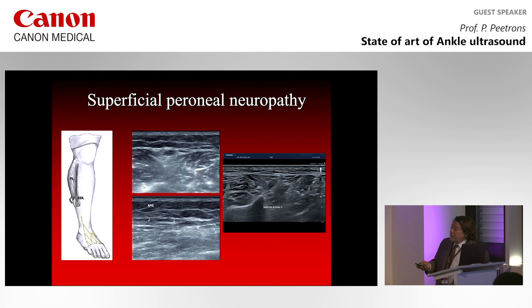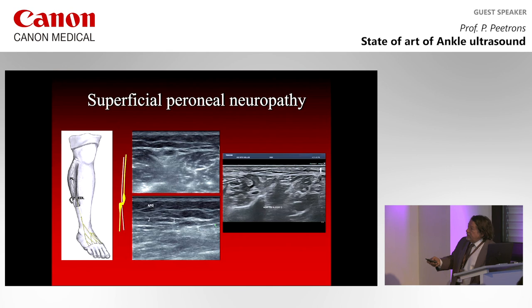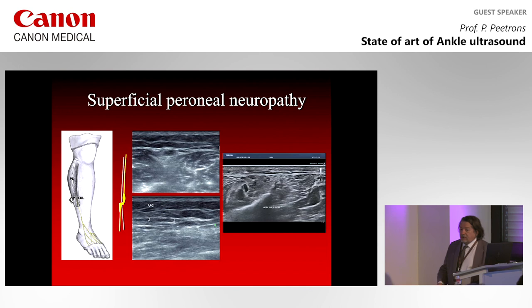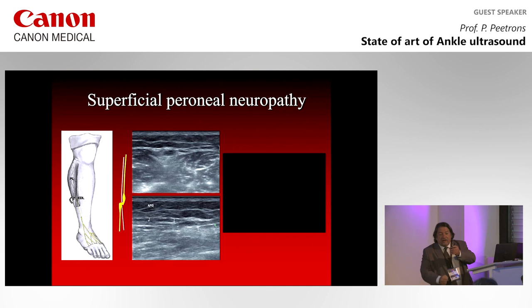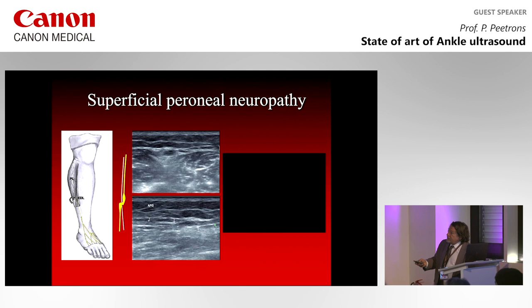So more or less 15 centimeters above the malleolus, then it stays under the aponeurosis of the leg for 5 centimeters more or less, and 10 centimeters above the malleolus, it goes to the skin, just underneath the skin. So in this portion, the nerve is just in between aponeurosis, muscle, and skin. And of course, when you have recurrent sprain of the ankle, recurrent inversion sprain of the ankle, you are pulling on this nerve a little bit, and this can lead to a little neuroma at that level, when the peroneal nerve is crossing the lateral fascia of the leg.